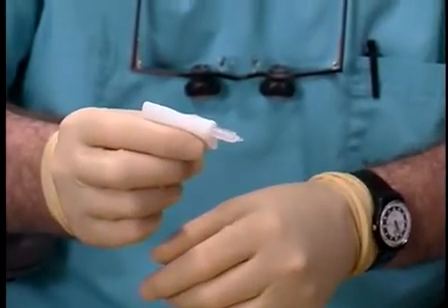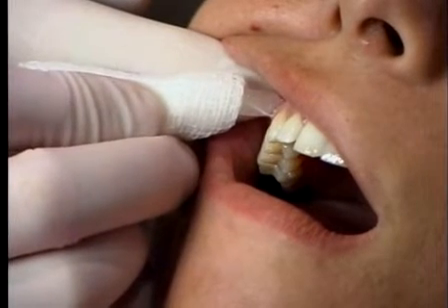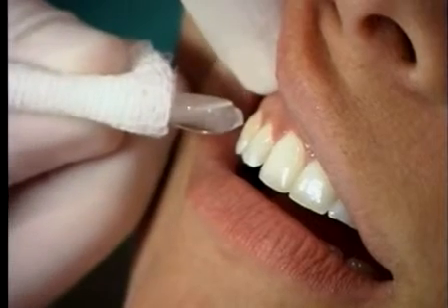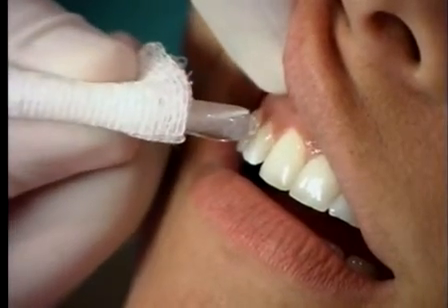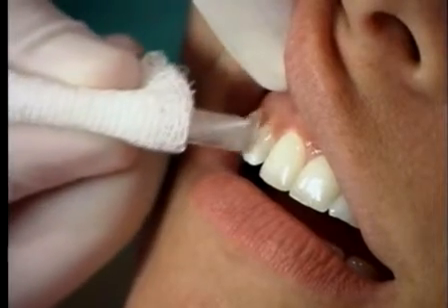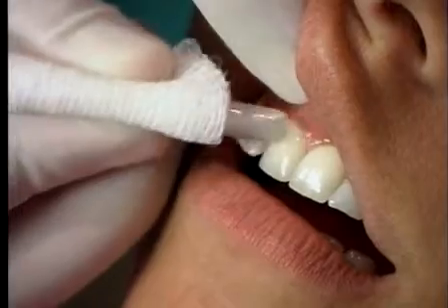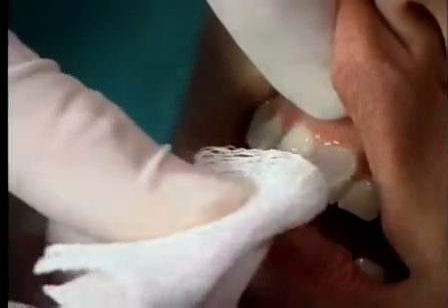This is wrapped in a 2x2 gauze, and I like to first place the ice on the patient's soft tissue. This way we can begin to eliminate the possibility for a false positive. The best way to conduct the test is to place the ice as close to the free gingival margin as possible, as this is the closest distance into the pulp. The carpules move back and forth, which creates a slurry of cold water which can effectively penetrate into the tooth.